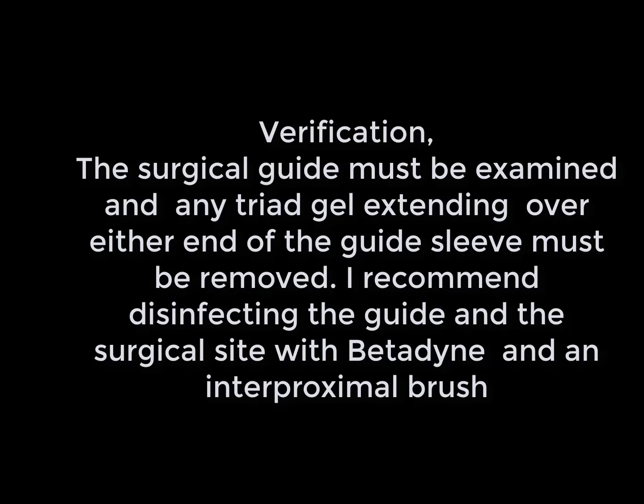The surgical guide must be examined. Any Triad gel extending over either end of the guide sleeve must be removed. I recommend disinfecting the surgical guide and the surgical site with Betadine and an interproximal brush prior to reflecting the flap.